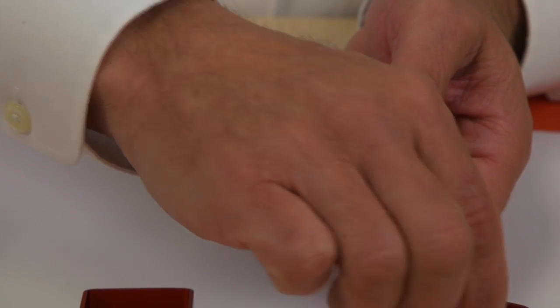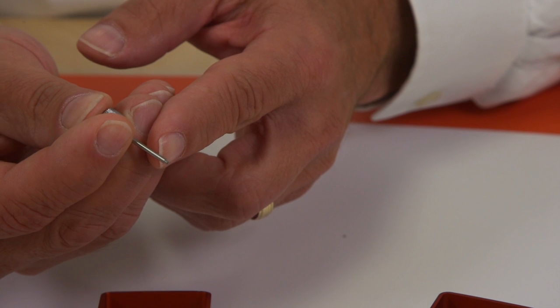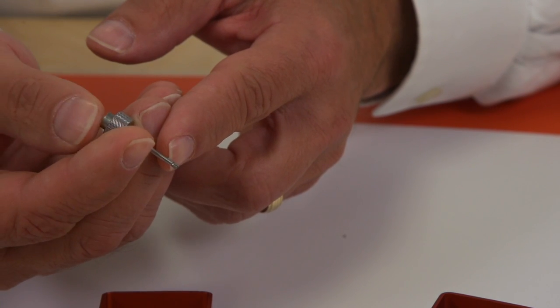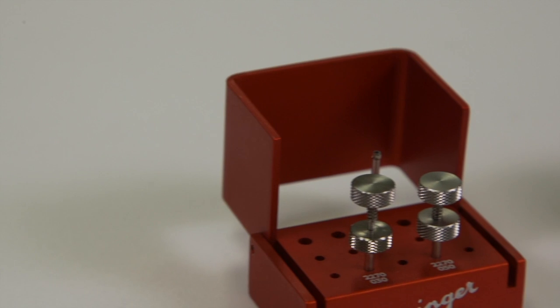The grippers work in a similar fashion. Slide them down and they're going to grab that metal post. Squeeze them together and remove the endodontic post. They're that simple.